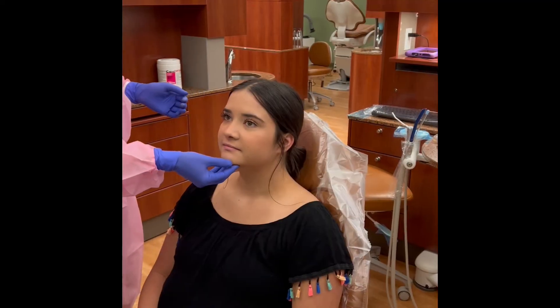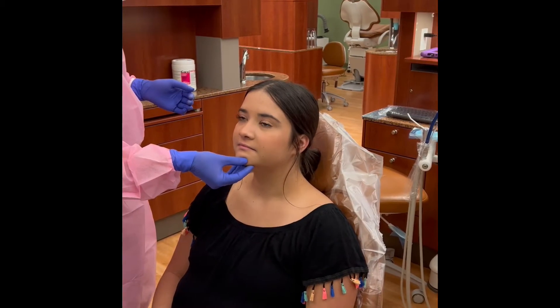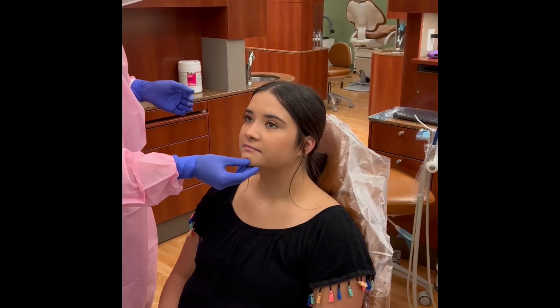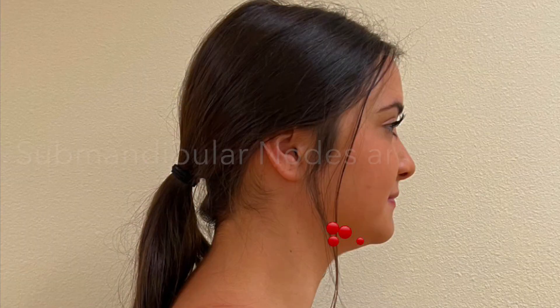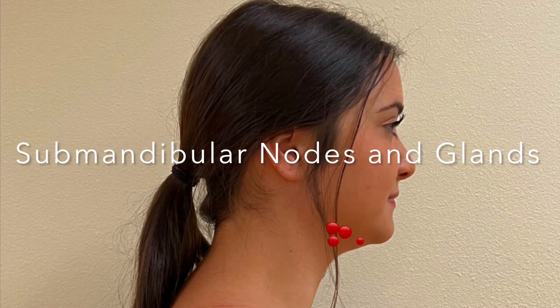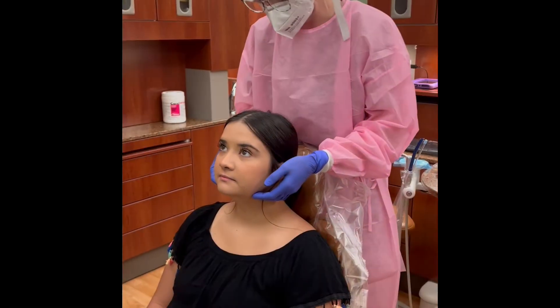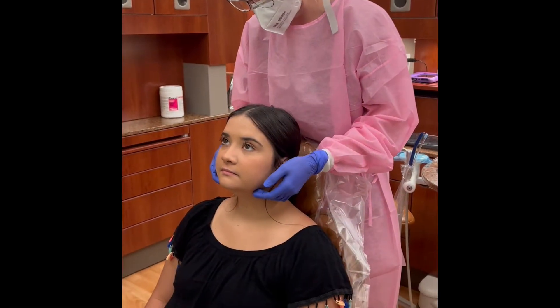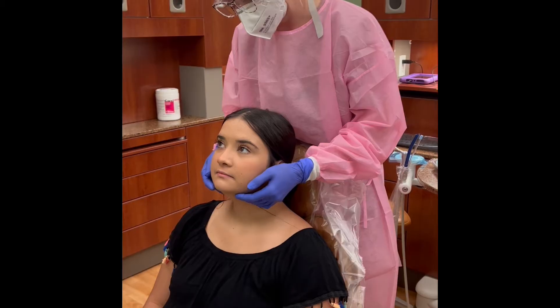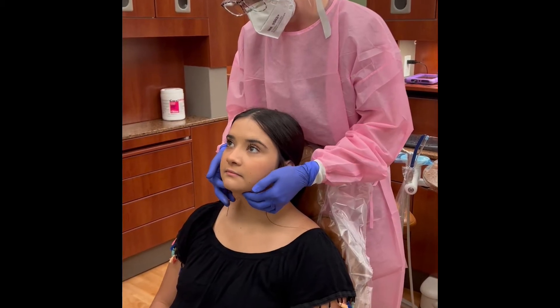Palpate the submental nodes and glands using digital compression with the thumb and index finger. Palpate the submandibular nodes and glands in a circular motion by rolling the tissue over the mandible.